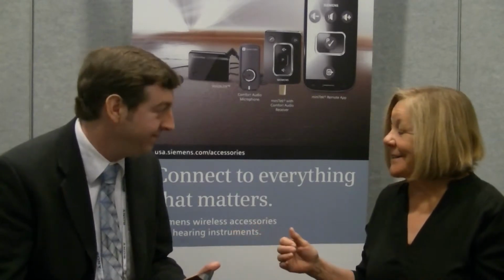So it's my understanding that I can use this to program it to my environment. So if I'm in a really noisy restaurant out for my date night, and I want to be able to hear you talking, I can use this to program it to filter out all that noise and amplify your voice. Yeah, so what would happen is the hearing aid will automatically adjust for that environment, or we can actually have a special program in the hearing aid, and you would just pull this out and go right to that program.